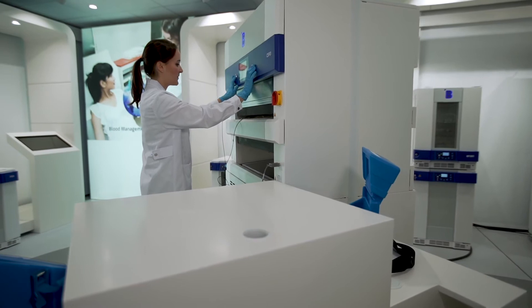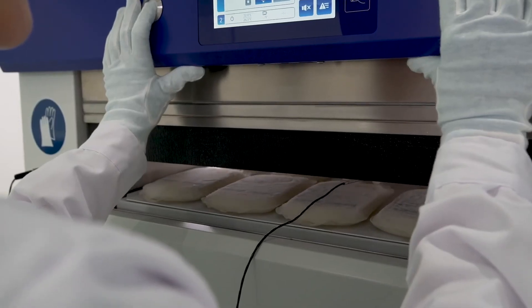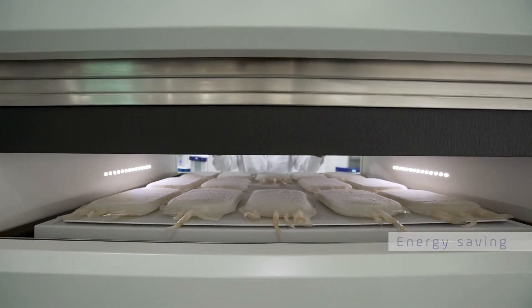Lay back and let B Medical Systems do the work. Proceed with the unloading at any time. The Eco Mode will ensure that your freshly frozen plasma is kept at the right temperature.